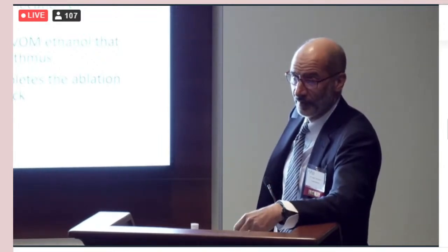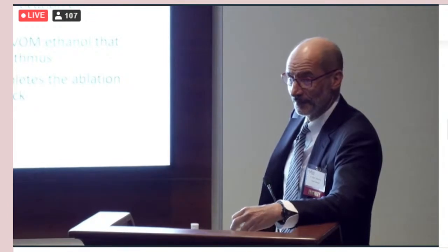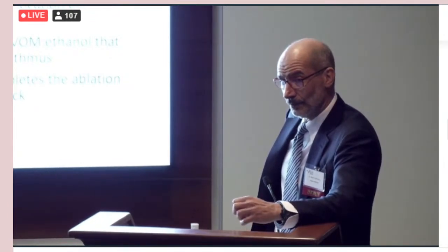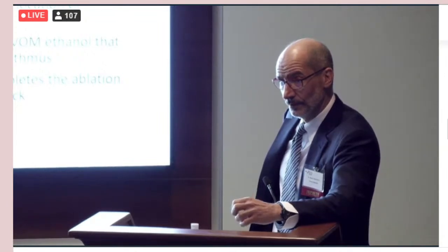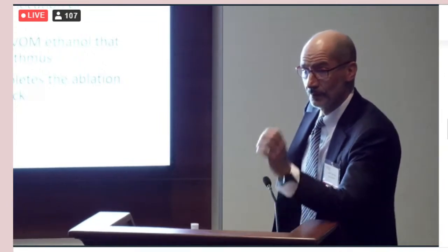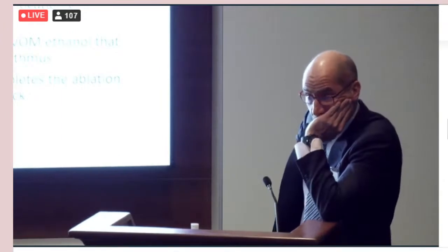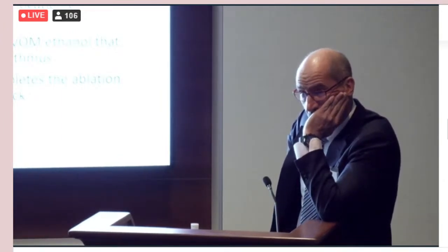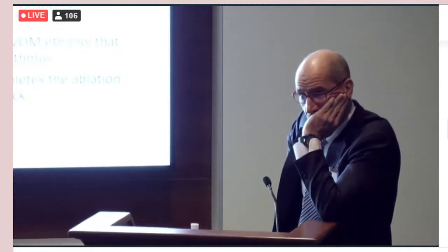I know that's why I'm asking, because people want to replicate. The other thing is, you are good at doing this now, but once you try to open this to many people, there are possible complications with the cannulation, and they may be minor, but they are there. And I learned from Andrea, we do CS isolation, and we go up and down into the CS.